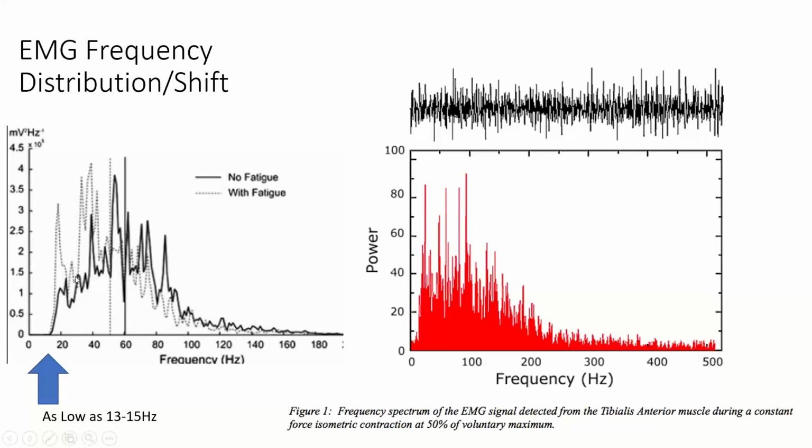And here you can see, kind of on the left side, a standard distribution. At the bottom is the frequencies, and up on the left side is millivolts, not microvolts. And microvolts is way down here below 1. So we're looking at no fatigue. So this is somebody who's freshly contracting their muscles, like if they're clenching their jaw or frowning.